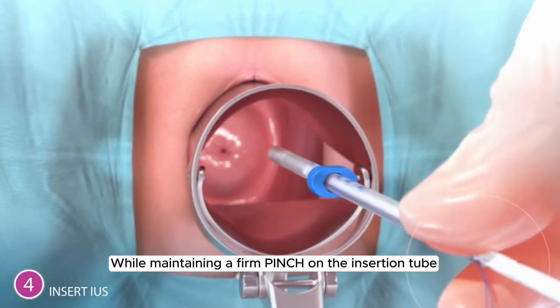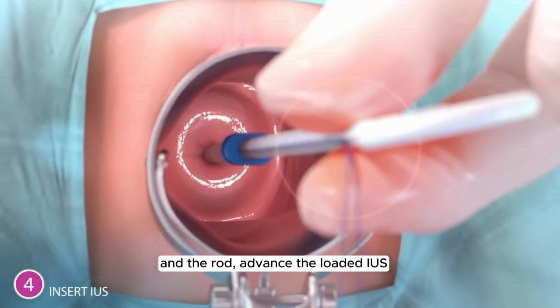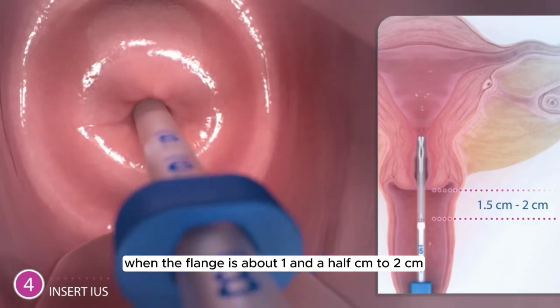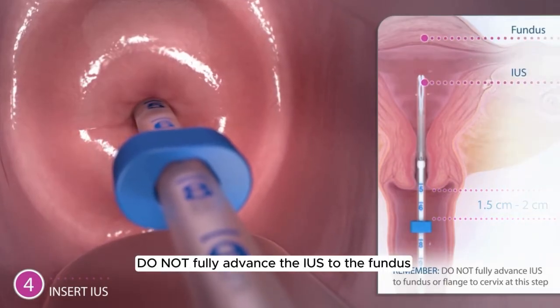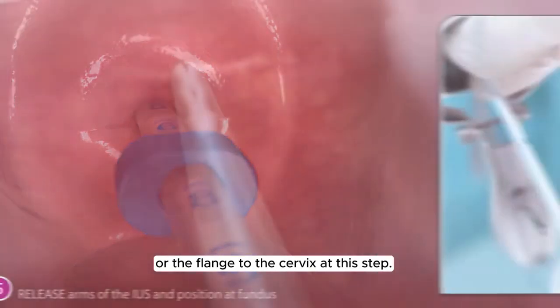While maintaining a firm pinch on the insertion tube and the rod, advance the loaded IUS insertion tube through the cervical canal. Stop when the flange is about 1.5 cm to 2 cm from the cervix. Remember, do not fully advance the IUS to the fundus or the flange to the cervix at this step.